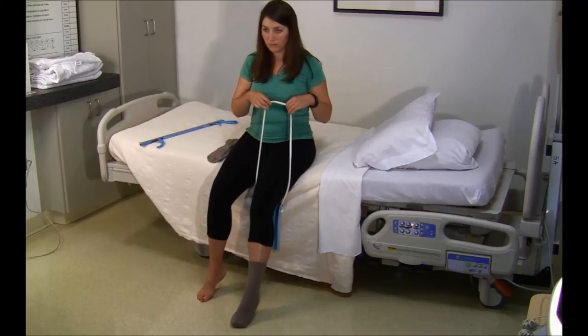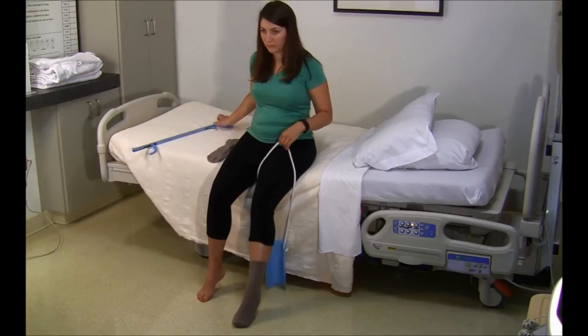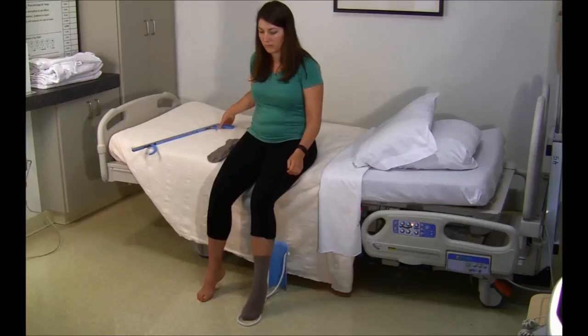However, if you need to adjust your socks, you can use your reacher to do so. To maintain your hip precautions, drop the string to the ground and use your reacher to pick up the stocking aid.